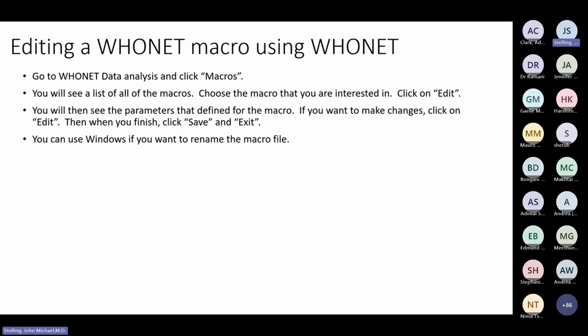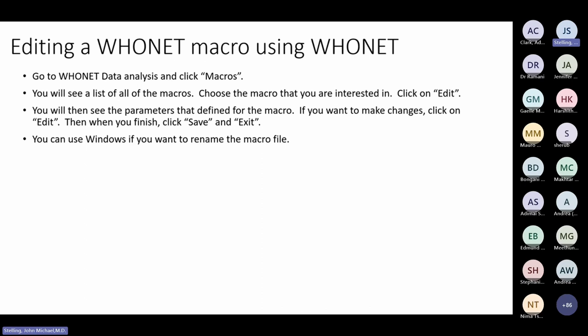Most people create their macros, use them, and don't need to edit them. However, there can be advantages to editing a macro manually — for example, to add another organism, change data files, or fix a spelling mistake in the macro name. Go to Hoonet data analysis, click Macros, see the list of macros, choose the one you want, and click Edit. Hoonet will show you the parameters defined in the macro. If you want to make changes, click Edit again, make the changes, then save and exit. You can also use Windows to rename the macro file.